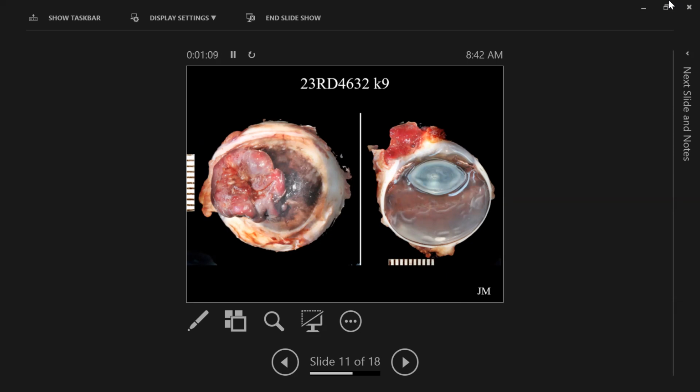All right, so this next case that we have for you is from an 11-year-old neutered retriever mix. This dog was diagnosed with chronic superficial keratitis in both eyes since 2017. It was initially diagnosed in the southern United States. They describe a large, firm, broad-based, red, multilobulated mass arising from the corneal surface and preventing visualization of most of the cornea. It's been unresponsive to neopolydex and Optimmune treatment.